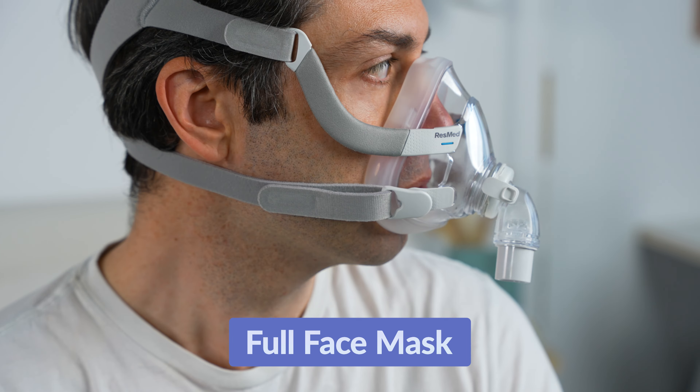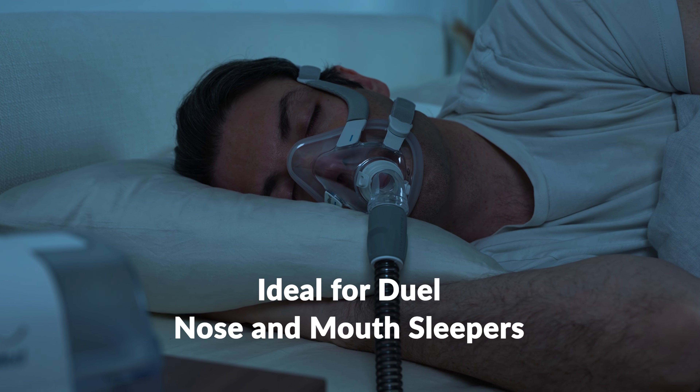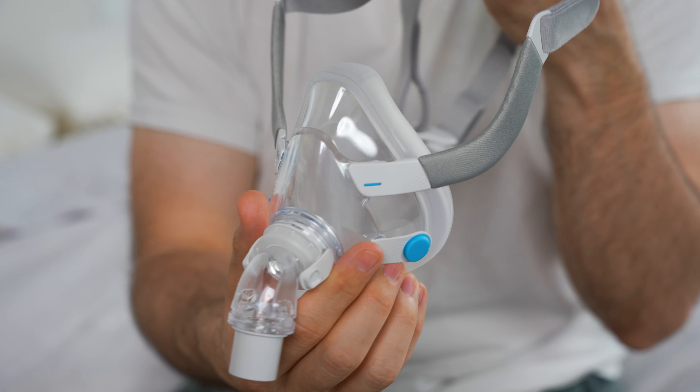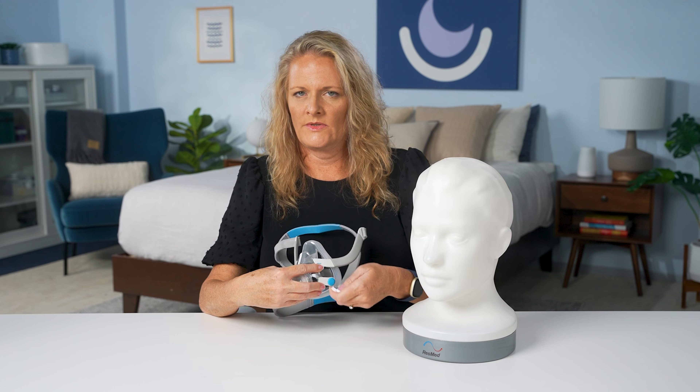On to the full face mask and how it works. This mask covers both the nose and mouth, providing a comprehensive seal from under the bridge of the nose to just under the chin. This ensures effective therapy for users who breathe through both their nose and mouth during sleep. Many of these masks also come with fit packs that include various sizes to accommodate different face shapes and sizes.